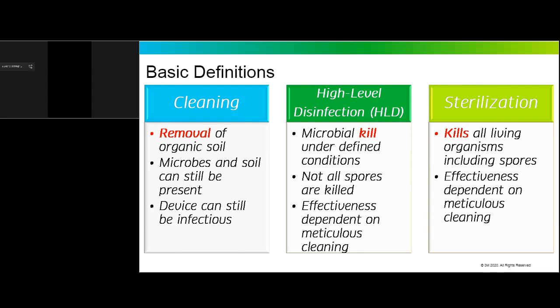Then moving over to sterilization, the sterilization process, by definition, destroys all microorganisms, including bacterial spores. So sterilization of critical instruments is a very important step in your clinic's infection prevention process to help minimize patient-to-patient disease transmission, going back to breaking that chain of infection.